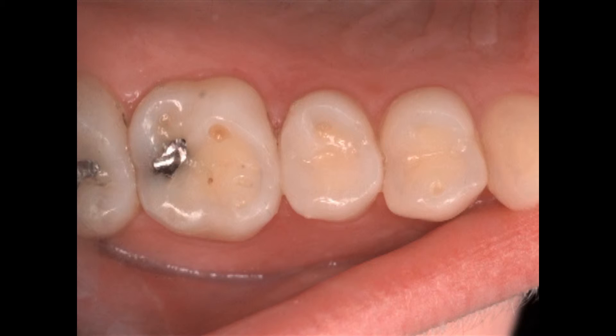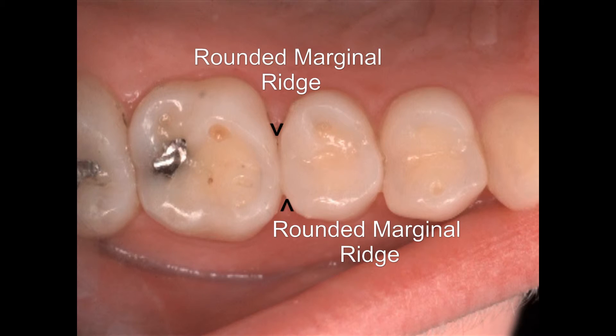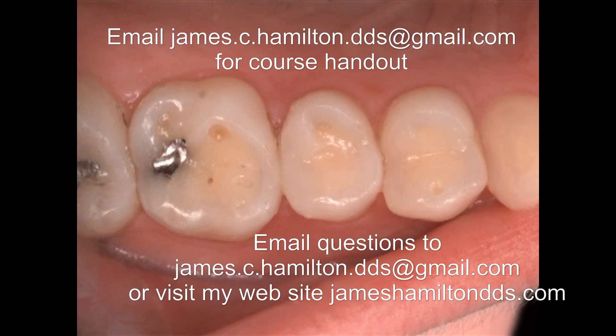Here we are with our rounded marginal ridge and very little occlusal adjustment to do on a patient who, as you can see, has worn a lot of tooth structure away due to bruxism.